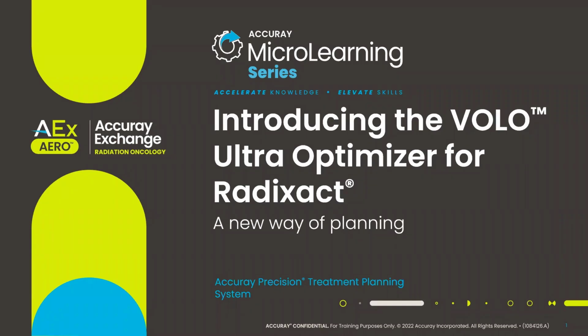But these past few years have been especially reminiscent of that same initial excitement that I had early on. And that's due to our recent releases of Synchrony and KV imaging, both of which are unique technologies to our systems, but they're also an opportunity to offer higher quality treatments to our patients and provide a delivery system that can give you that differentiating factor for your clinic. But now, in addition to those amazing technologies, we also have another product that we've added to our lineup, and that's our VOLO Ultra new planning software. So I'm really excited to introduce our new optimizer to you and to show you how special VOLO Ultra really is.